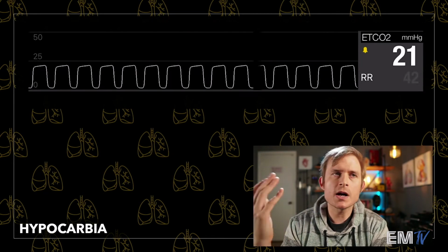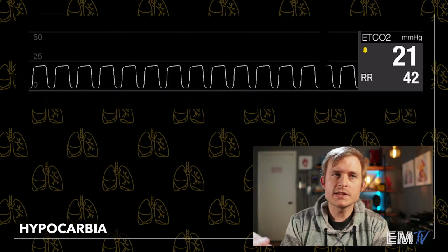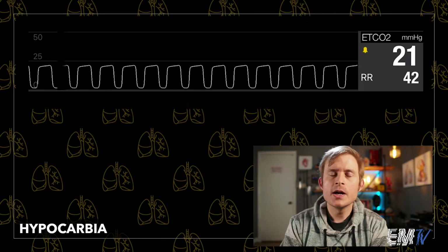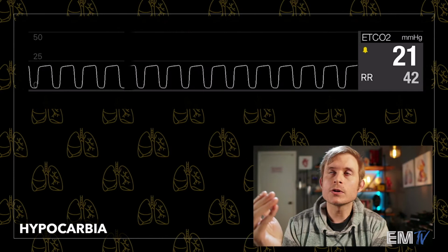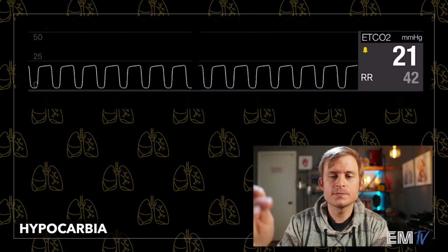Very easy to apply. You would simply put on your nasal cannula, end-tidal CO2 with the little reservoir bleb, and you would monitor it from here. But again, same normal shaped wave, but it is a much smaller amplitude and a much higher respiratory rate in this case.